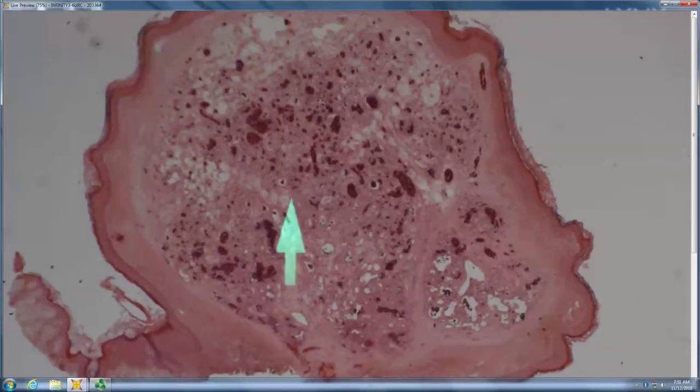There's some septa in there, and it is septated, right? And you have to have fibrous septa in order to call it a PG. It's a lobular eruptive capillary hemangioma. So, very good.